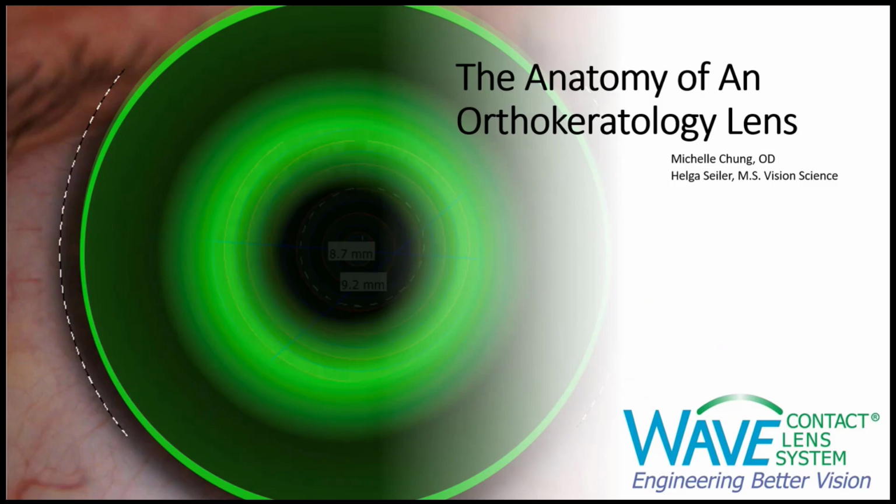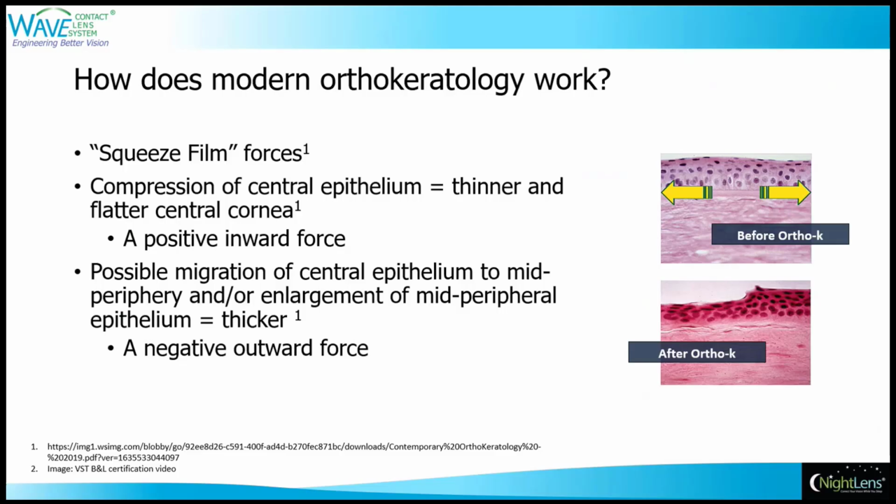The anatomy of an orthokeratology lens. In this video, we will break down the components of an Ortho-K lens and explain how each dot corresponds to each adjustment. So how does modern orthokeratology work?